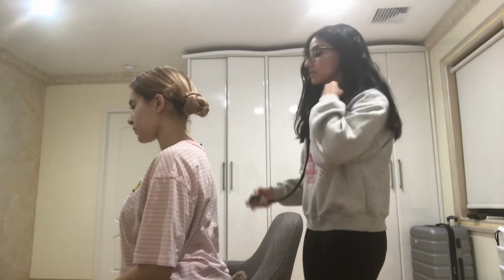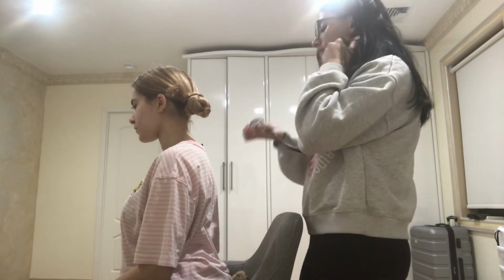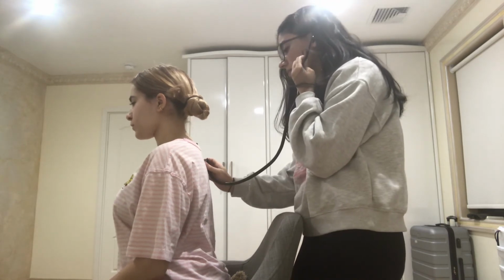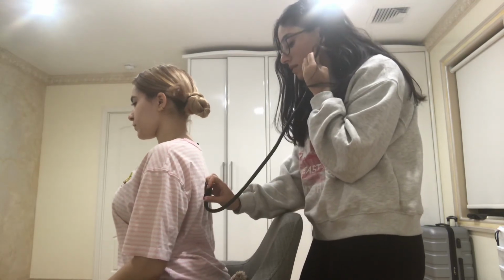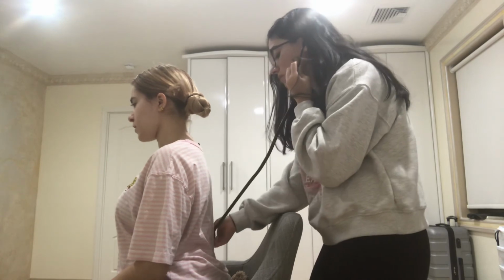Now I will begin auscultating. Okay, please take a deep breath in and out, in and out, in and out. Okay, breath sounds sound normal, no abnormal breath sounds.